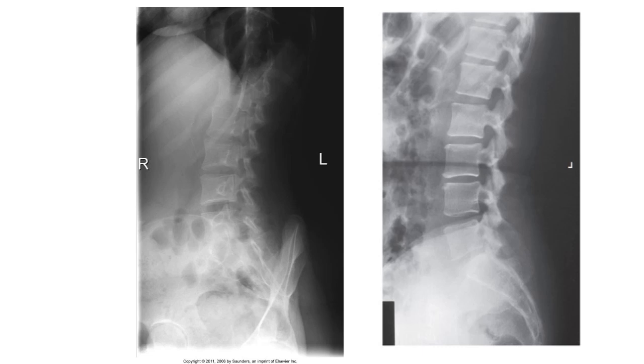And this is an example of where these are the pedicles here with the notches that we can see, and we shouldn't be seeing that pedicle so far posterior. It's almost a lateral projection.